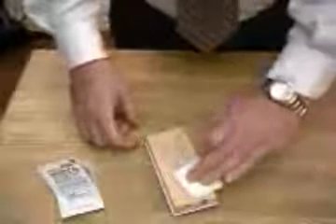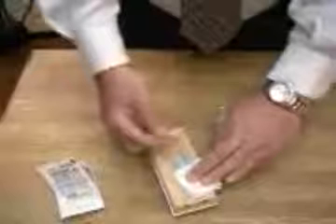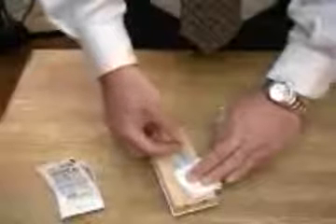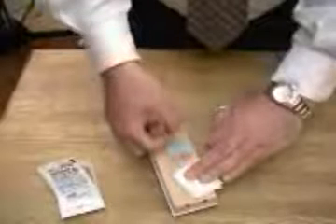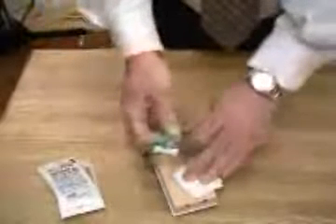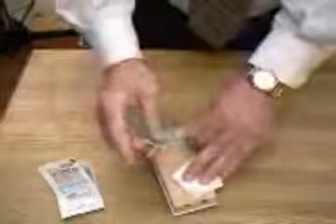So what you do is you apply pressure, grab the device by the very rear. You'll see here that there is a little triangle thumb pad. What you want to do is apply pressure, extract, turn the needle away from you, grab the tubing, and activate the safety shield.